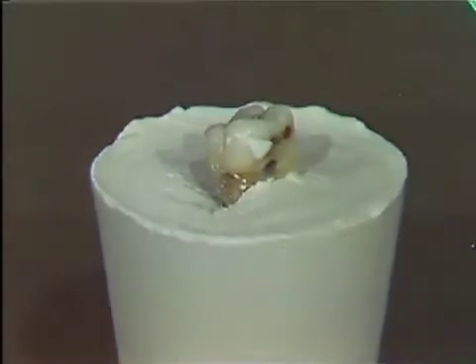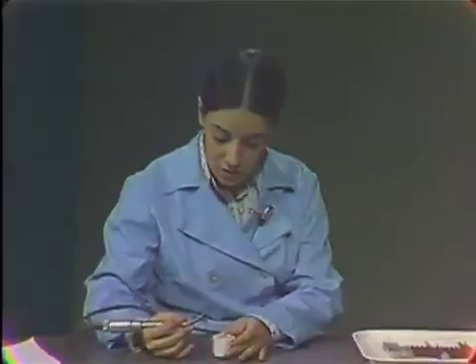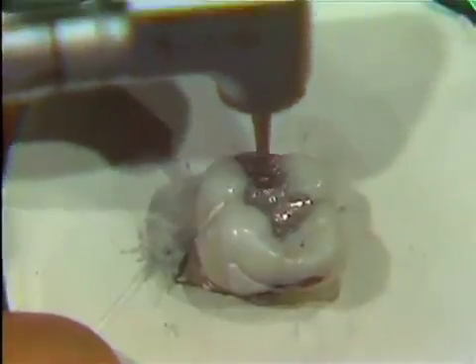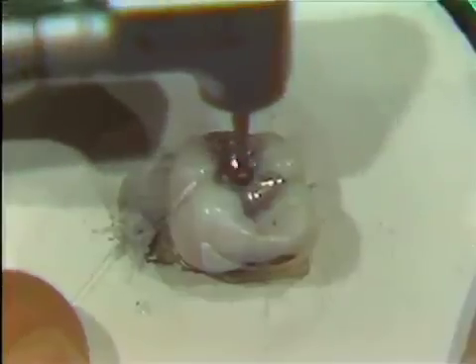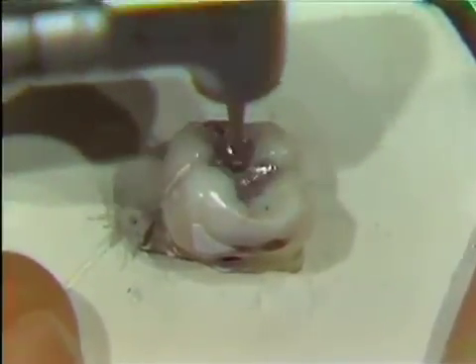You may also use your 242 burr on class 5 amalgams. Just be careful that the point abrades neither the cementum nor the tissue. Now we're going to go to the plug finishing burrs. There are three sizes, and we usually work from the smallest to the largest. The smallest burr is used to define anatomy. When you are cutting your grooves in the anatomical form, don't aim for long pointed troughs — rather, have a more rounded type area so that it will be easy for your patient to keep clean. So you cut your basic anatomy with the smallest burr, then you will move to your medium-sized plug finishing burr.